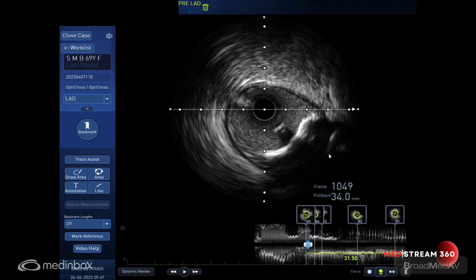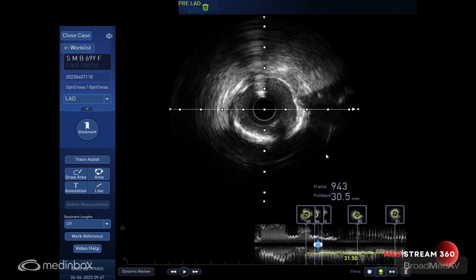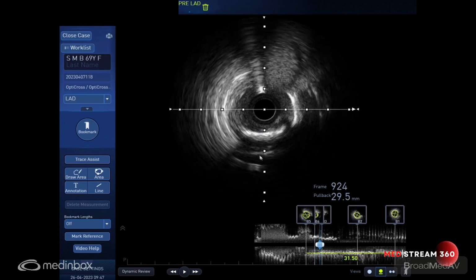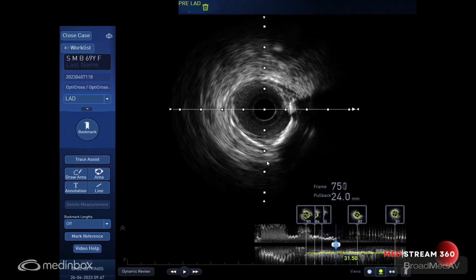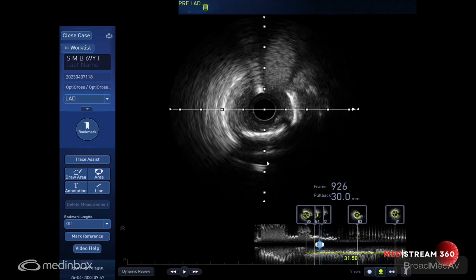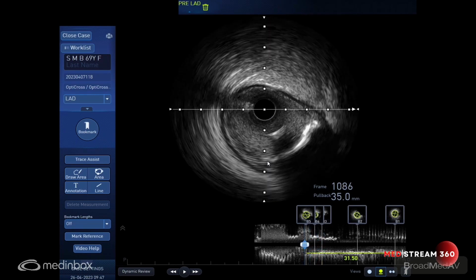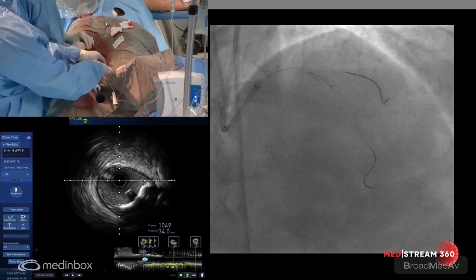I will tend to use a cutting balloon here. All right, so we will use a 3.0 Wolverine. Can we open that to nicely prepare the lesion? Then do an IVUS once again to see how much fracture we've got of the calcium, and then possibly decide about the stenting strategy. So keep the IVUS ready after this, please.